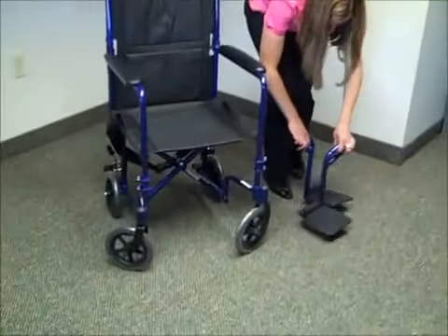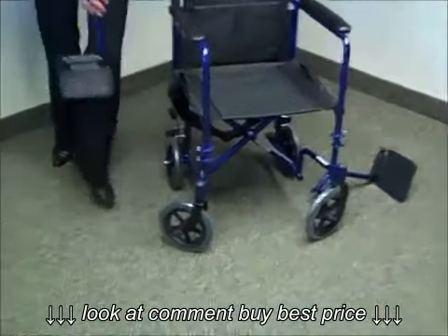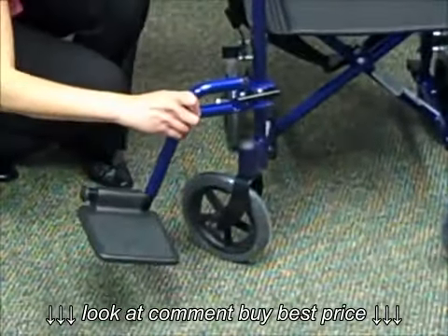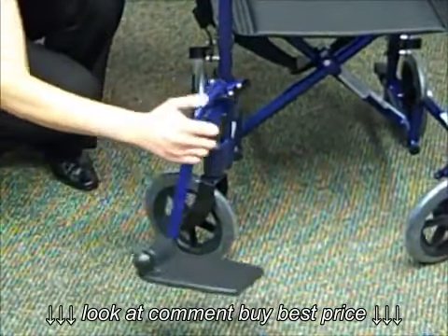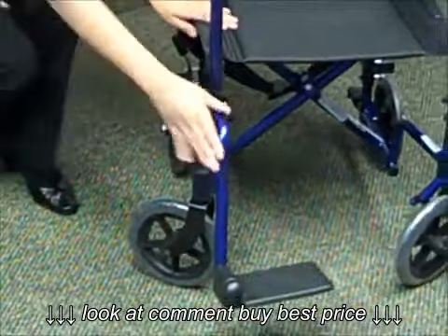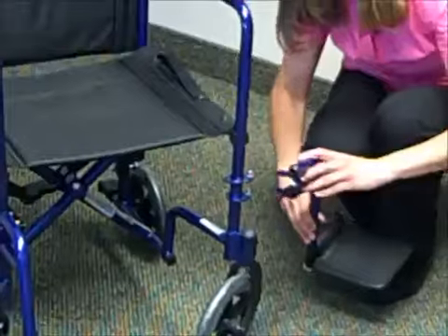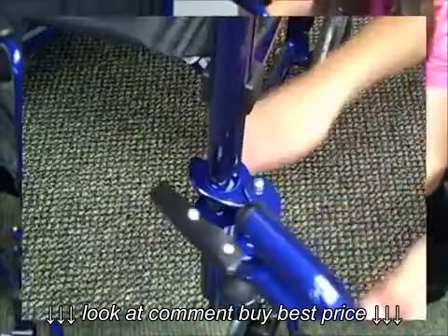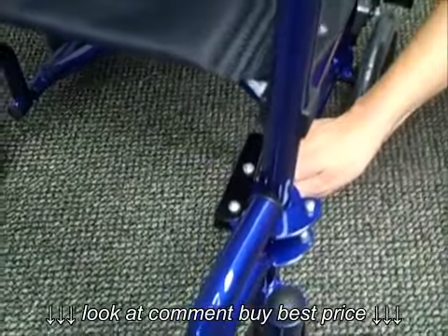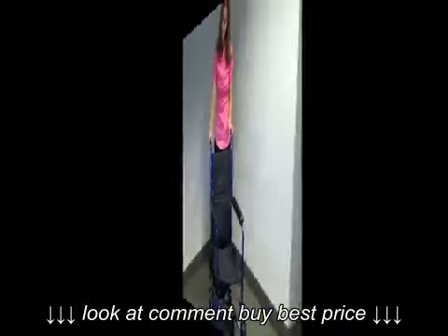Now you're going to add the footrests. You also want to make sure those click in and they're nice and secure. Go ahead and assemble the other footrest — make sure you hear that click. Now your chair is assembled.